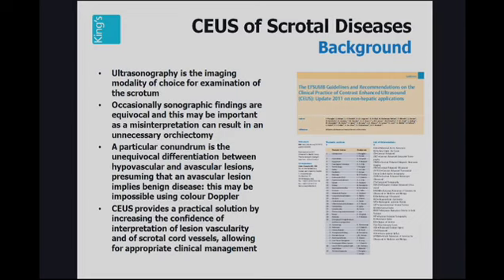I've already said that ultrasonography is the imaging modality of choice for examination of the scrotum. It is unrivaled in this area, and most operative procedures are based entirely upon the ultrasound findings. But occasionally these findings may be difficult to interpret, and any misinterpretation has the possibility that the patient may lose the testicle.